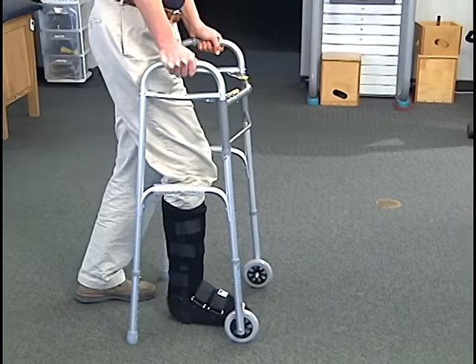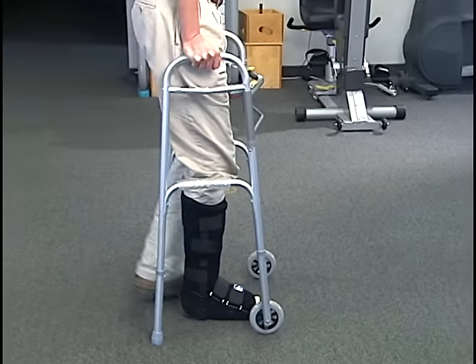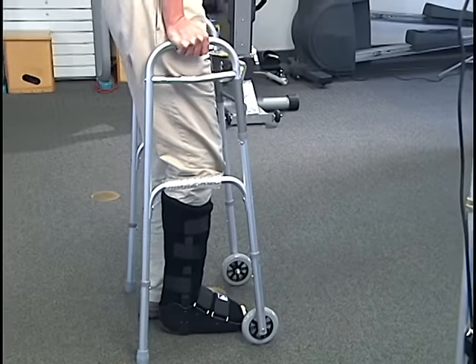More than a touchdown level, obviously, but because you are using the walker and using some of the weight-bearing on your arms, you're taking about half the weight off your foot.